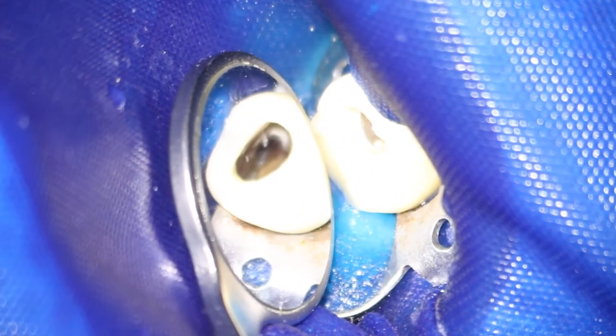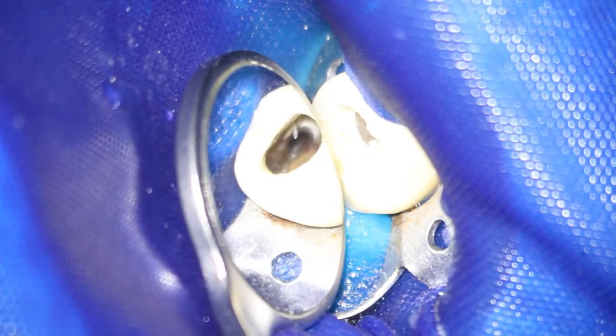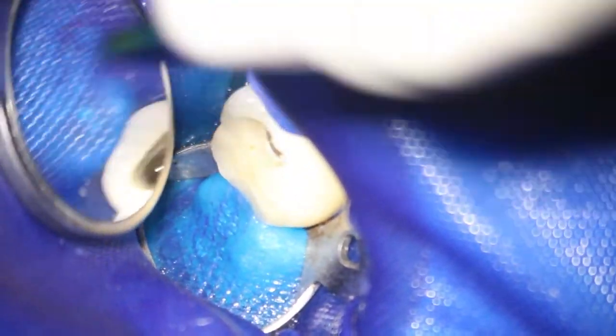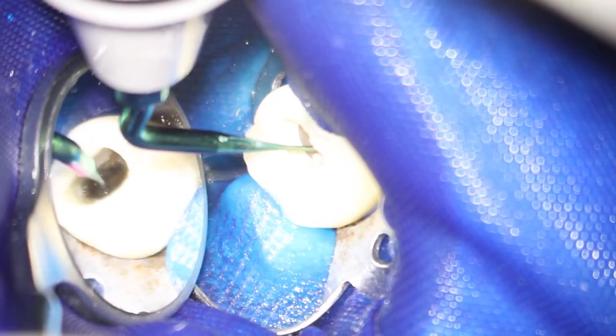Now you can see how clean the canal is after the first irrigation with ultrasound application. Then the next irrigation sequence has started because there are still parts of necrotic tissue inside of the canal.